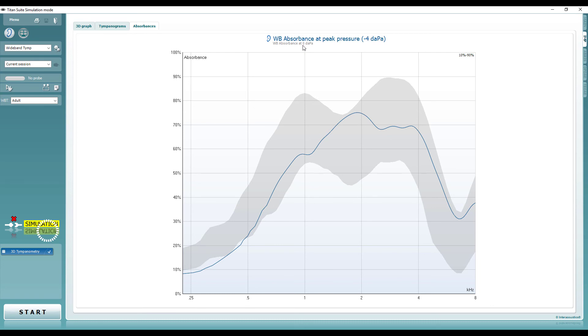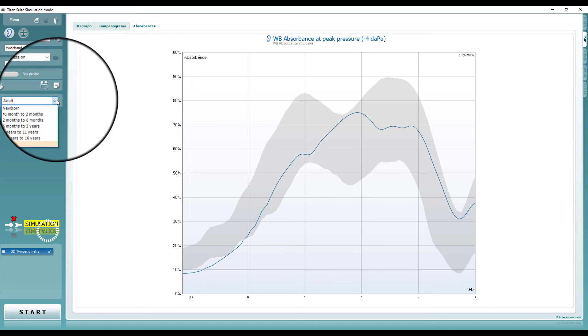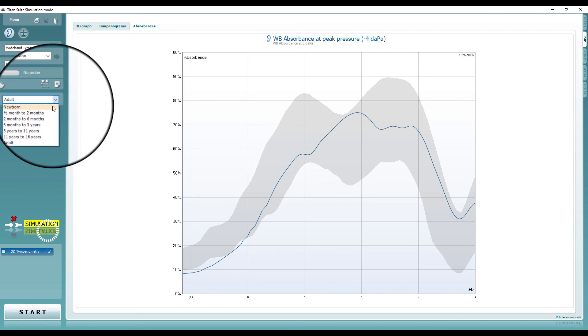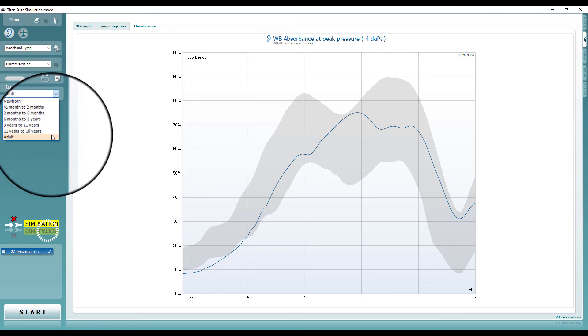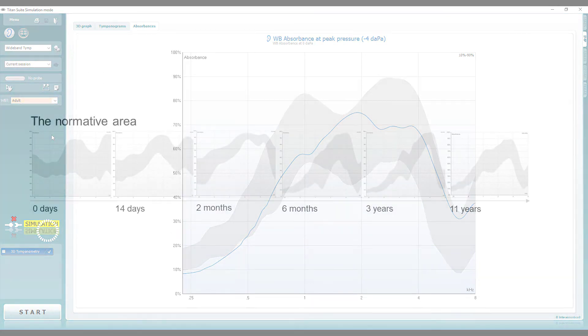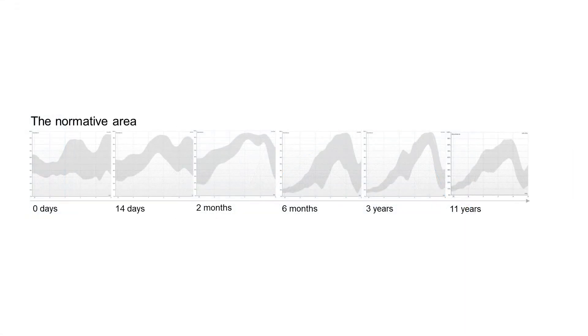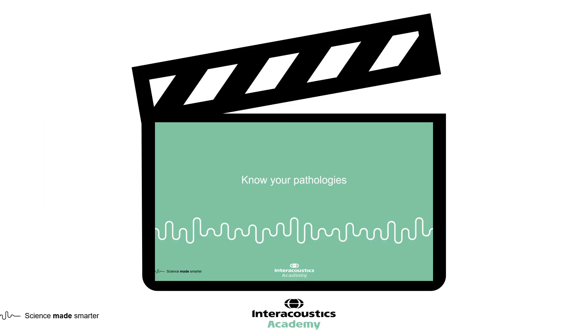The absorbance graph displays how much energy is absorbed by the middle ear. Normative values are provided for all age groups. Different absorbance patterns can be indicative of various pathologies. Please refer to the video tutorial, Know Your Pathologies, for more detail.